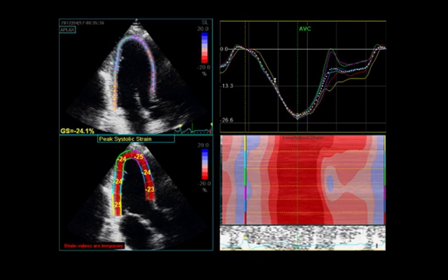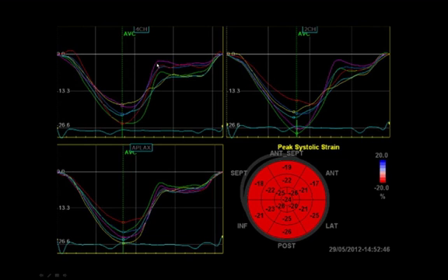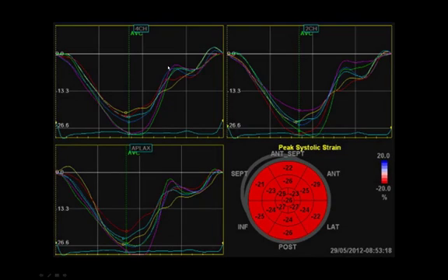So it's a very important message to me to see that. Every time I see a normal, I want to see purple and green here, lengthening quicker, or I would say with more liberty than the rest of the heart. It makes sense because we see the mid is stuck, the base is really fixed in a certain part, but the apex does have that motion.